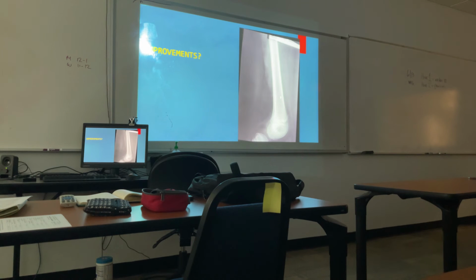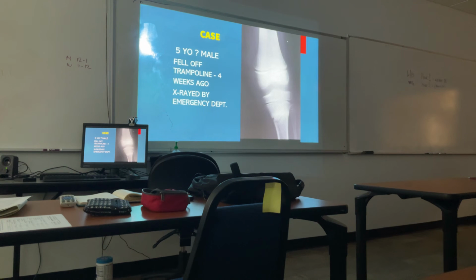What leg is it? We don't know. What we say is, in anatomic position, because the fibula is here, we're assuming it's the left leg. That's our supposition, because we accept anatomic position as a standard. If you can't tell, you're going to have to call the office and ask which limb was x-rayed.